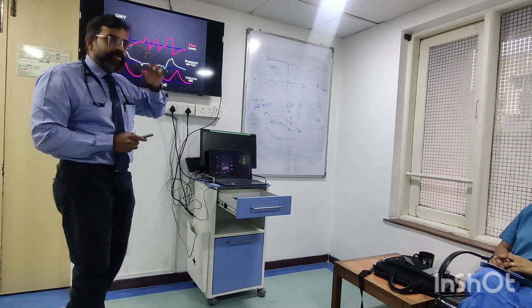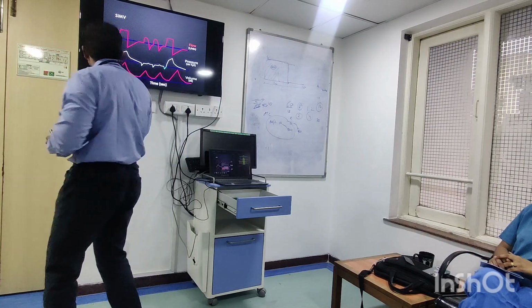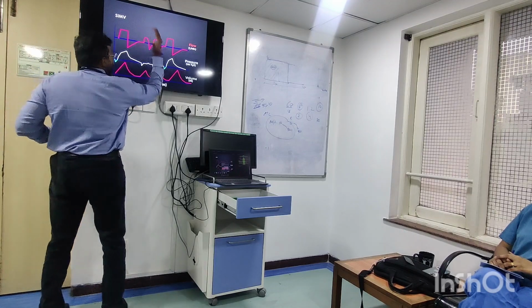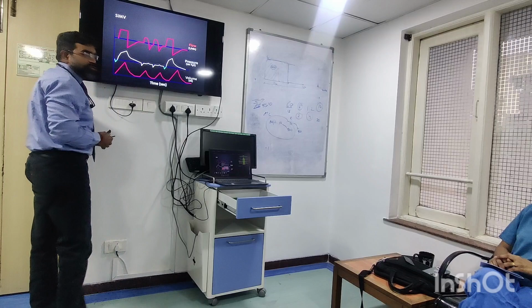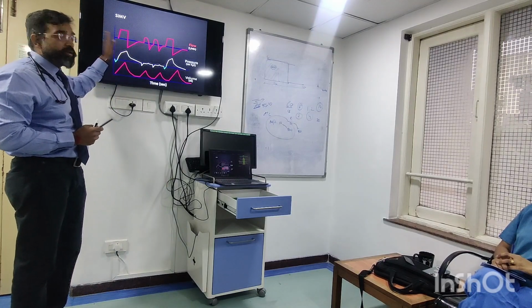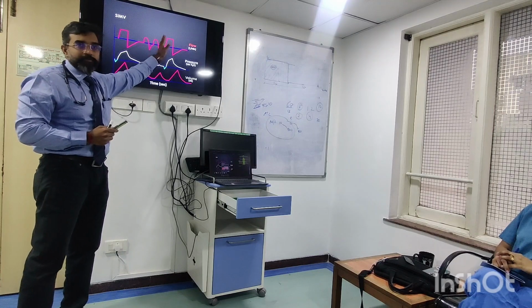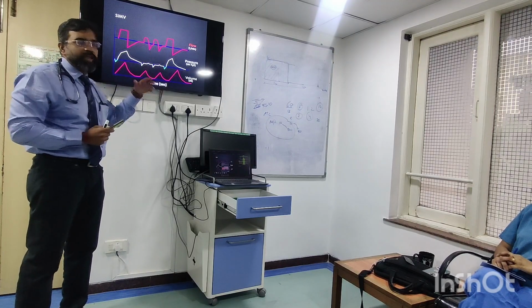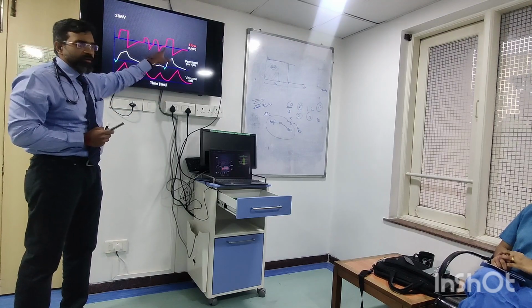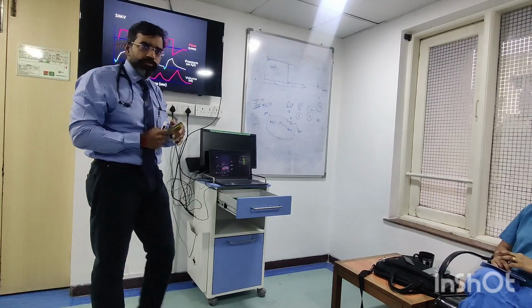Now there is a mandatory period, and this is a patient period. So there is a mandatory period of breath, and there is a free period, the SIMV period. In the middle the patient can breathe, he can inspire, he can expire. That's why it's going inspire, expire. The patient can do what he wants to do.